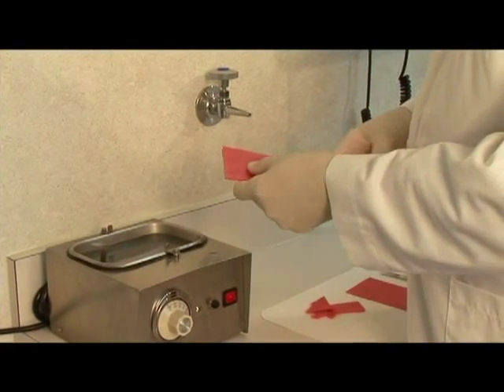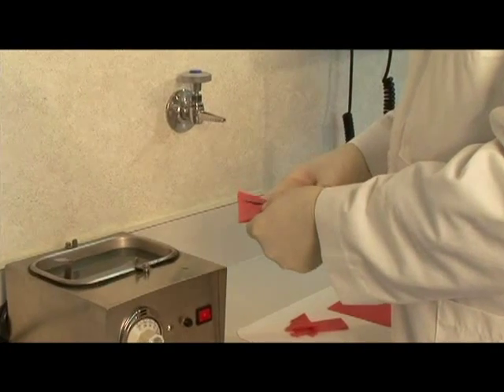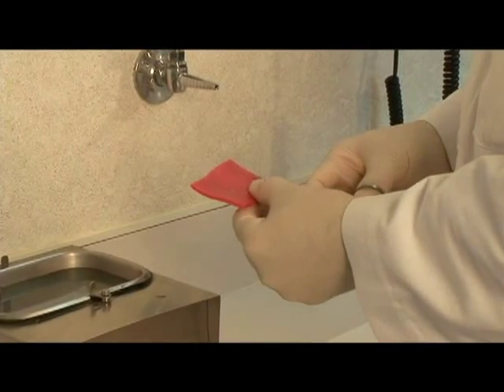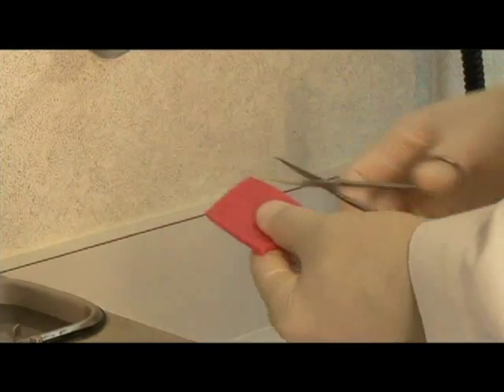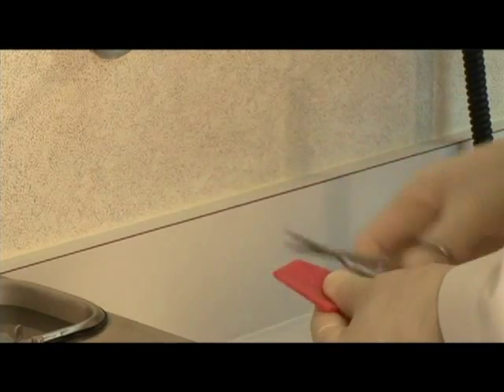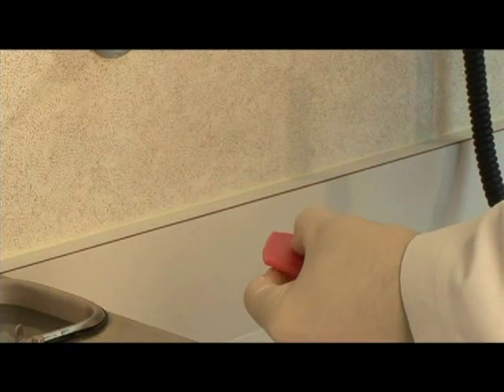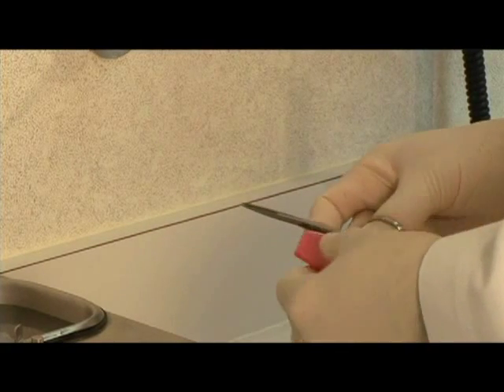We double it again, and we cut it much in the same manner according to the size of the dental arch that we will be recording. This time, however, we will be leaving the anterior region intact so that we can use that as a guide to be able to see the anterior teeth come end to end in the protrusive manner.